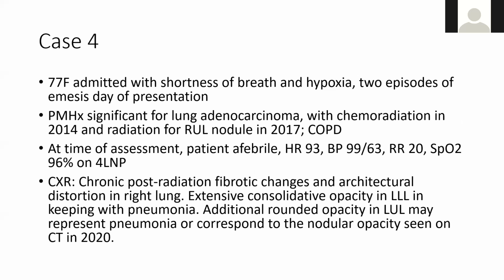Now moving on to the final case for today. This is a 77-year-old female who was admitted with shortness of breath and hypoxia. She also had 2 episodes of emesis on the day of her presentation, so potentially some concern of aspiration. Her past medical history is significant for lung adenocarcinoma with chemoradiation in 2014, as well as radiation to a right upper lobe nodule in 2017, and she also has COPD.